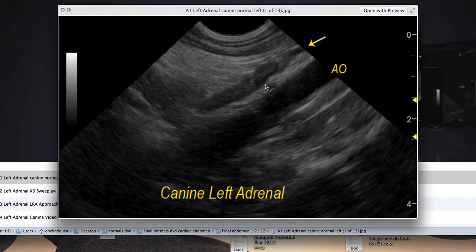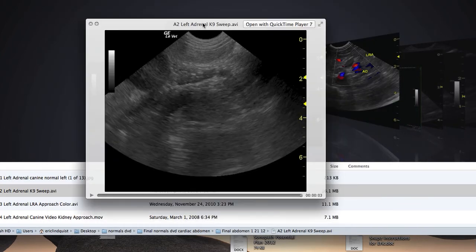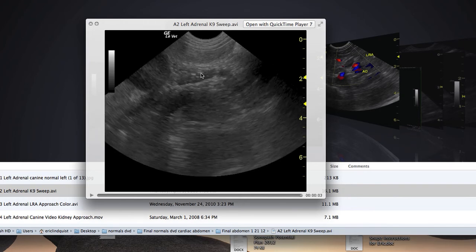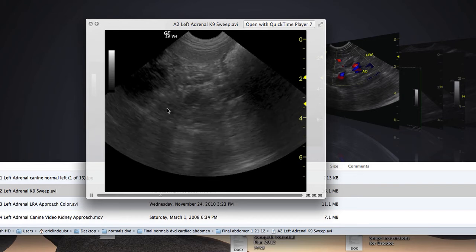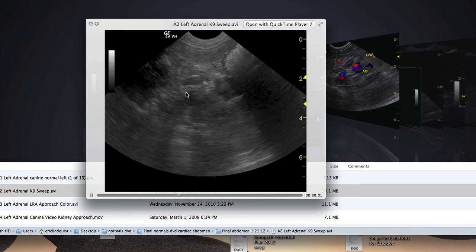If you use the scanning hand to apply gradual, widespread pressure onto the patient, this allows you to push the probe down to the left adrenal gland. I find the aorta first, and then there's the vessel called the left renal artery. The adrenal gland sits just cranial to that. In this video, we can see the left adrenal gland coming in — scanning at two centimeters, we have the aorta and the left renal artery. I catch the left adrenal gland obliquely, coming in behind the rib cage in the sublumbar area, finding the aorta and then the left renal artery, and catching the left adrenal gland at an oblique angle.